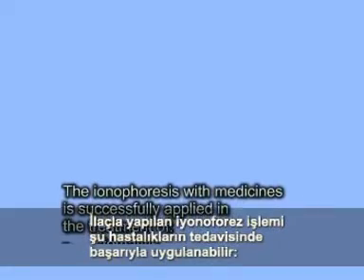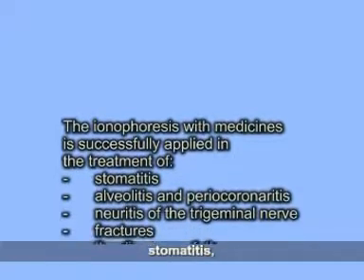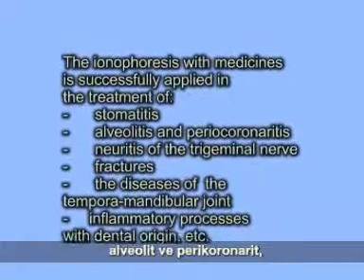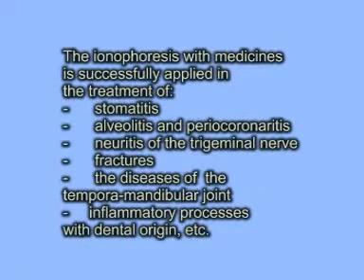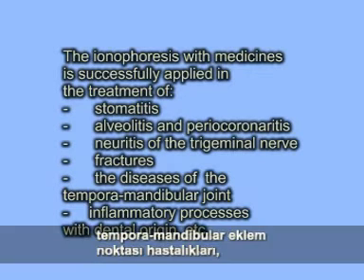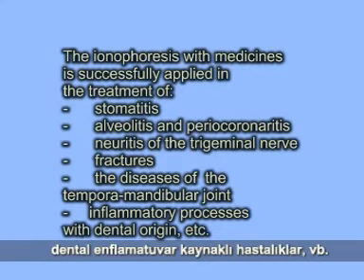Ionophoresis with medicines is successfully applied in the treatment of stomatitis, alveolitis and pericoronitis, neuritis of the trigeminal nerve, fractures, diseases of the temporomandibular joint, inflammatory processes of dental origin, etc.